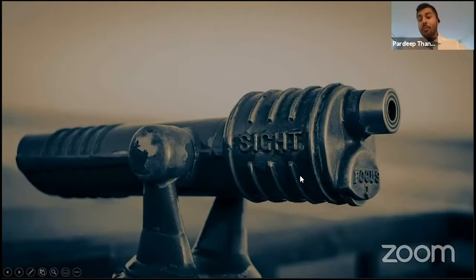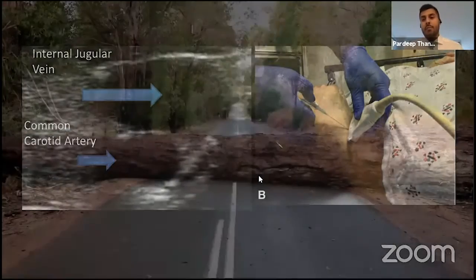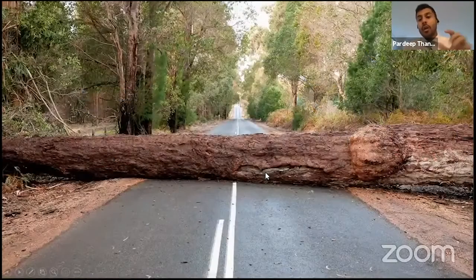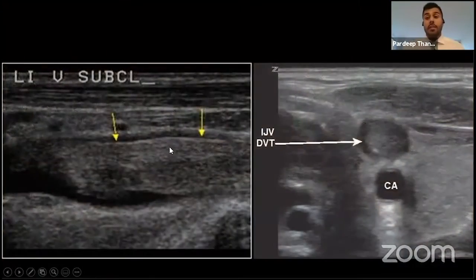All right, now let's move on to the most obvious thing in the room, this idea of sight. What am I talking about? Ultrasound. Ultrasound brings so much to the table, so we have to go into some of the things. When you're trying to go down this road or you're trying to get this vein, you might find a block in the way. One, you could have abnormal anatomy, but even if your anatomy is the same, you might see one of these in there: a nice big hyperechoic structure right in your vein.